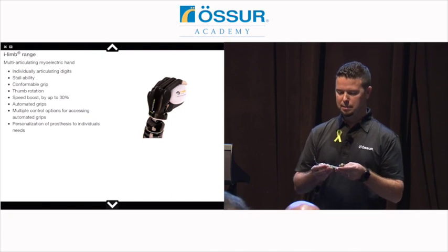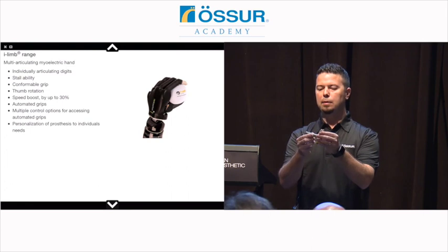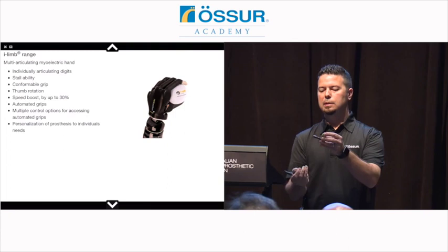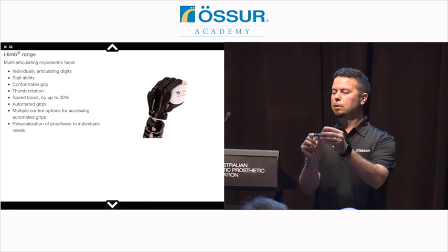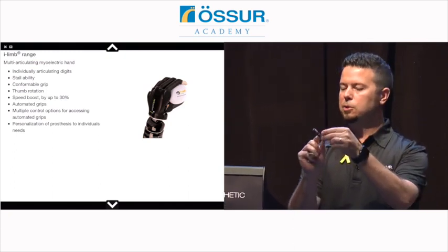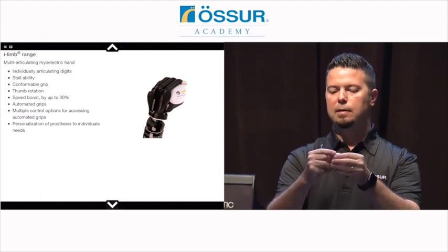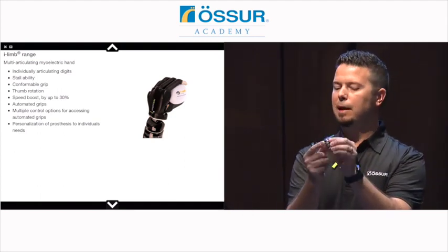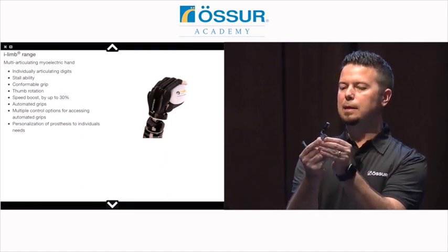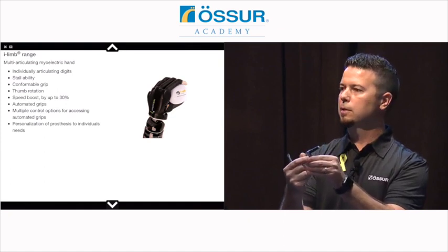Let's interact and discuss. So if you look at a finger, we've got a tip that is removable, and then what we call a proximal motor sleeve. And with that removed, what you see inside here is a Maxon motor. Spins really, really fast. And next to it is a transmission, or the engineers call it a gearbox. It just takes that speed and amplifies it into some force that spins a bevel gear in the back. And that bevel gear spins a worm and wheel. So as the motor spins, it either extends or flexes the finger. So as we pass this around, kind of get a feel for the technology that's in this.